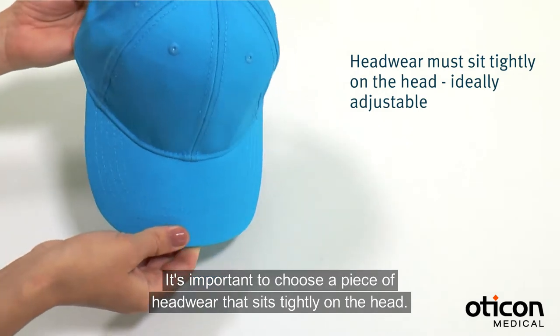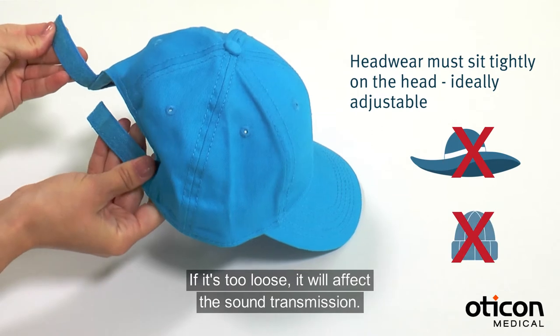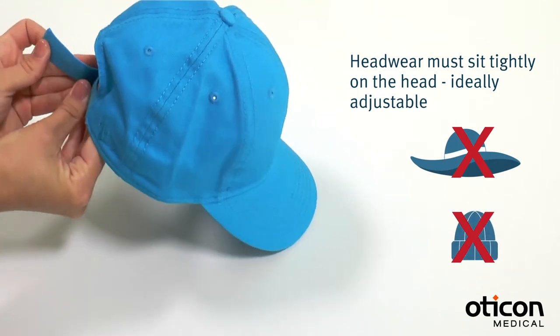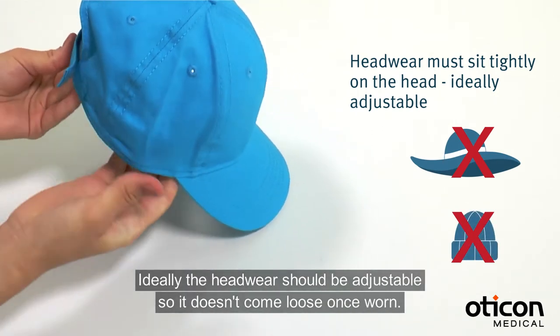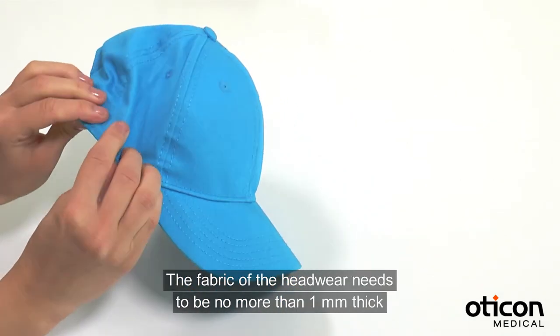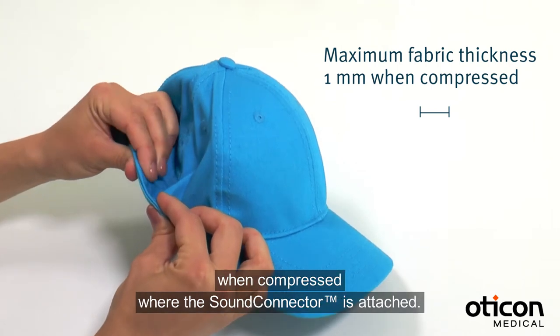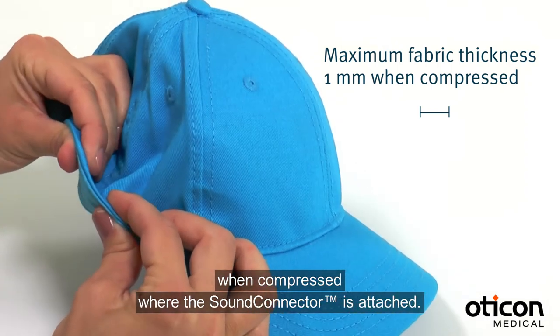It's important to choose a piece of headwear that sits tightly on the head. If it's too loose, it will affect the sound transmission. Ideally, the headwear should be adjustable so it doesn't come loose once worn. The fabric of the headwear needs to be no more than one millimeter thick when compressed, where the sound connector is attached.